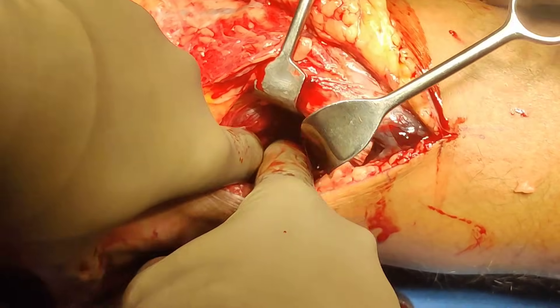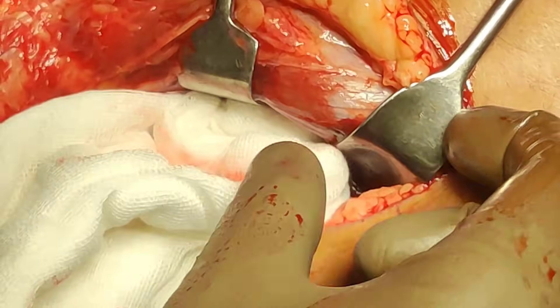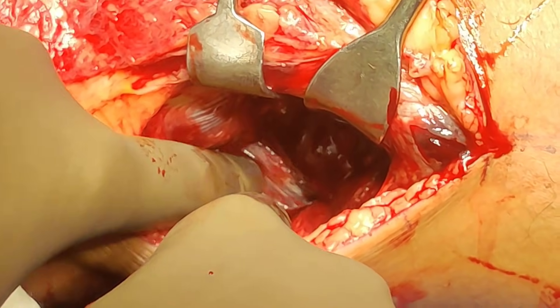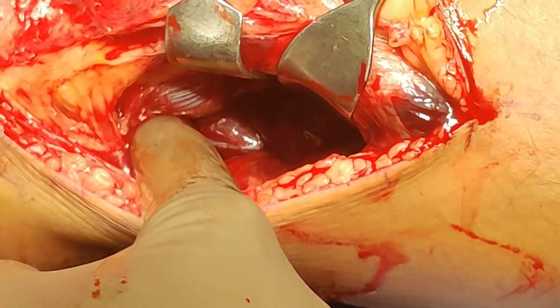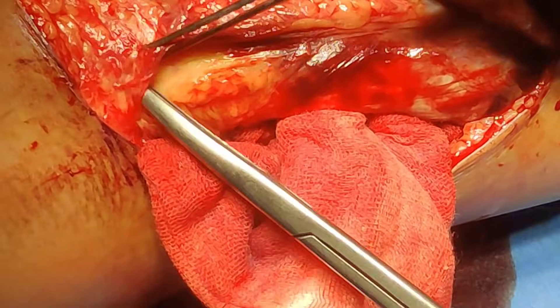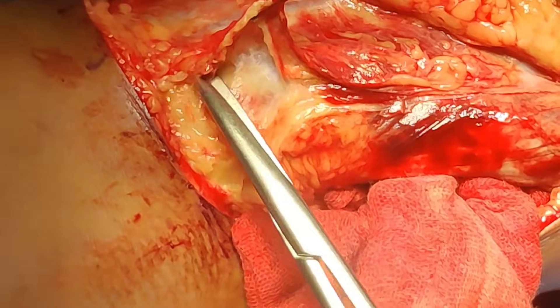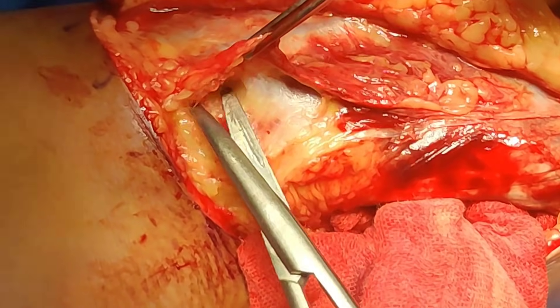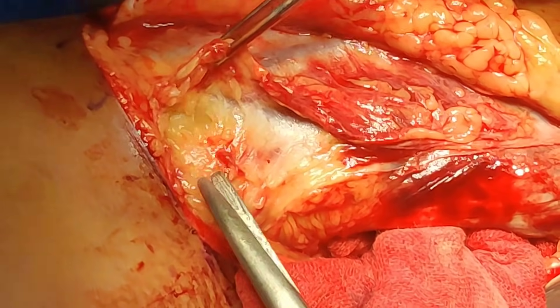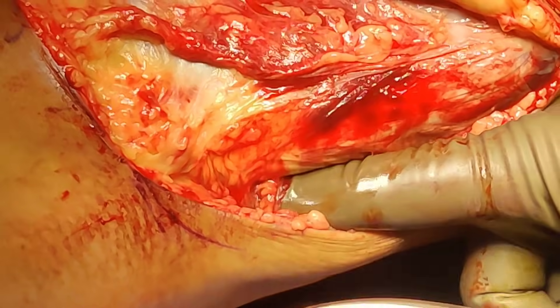You can see the soleus and if you go up slightly you will see the popliteus — you are right on the back. This is the soleus muscle and on top there will be popliteus. I am just opening the fascia in the same line of incision. Here you can see the short saphenous vein right there — we won't go any close to it. Because we need some proximal access, we have to make this incision slightly bigger.